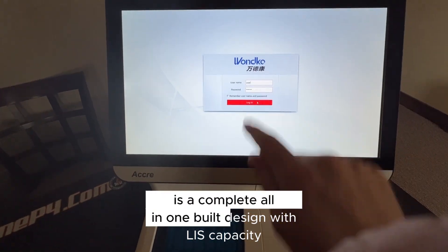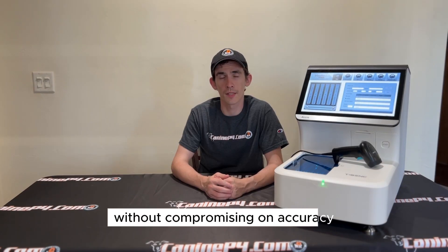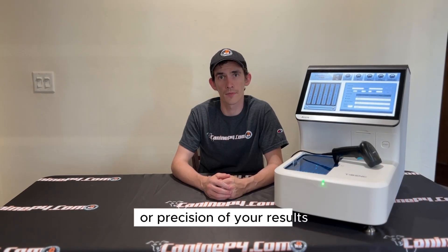It is a complete all-in-one built design with LIS capacity, without compromising on accuracy or precision of your results.